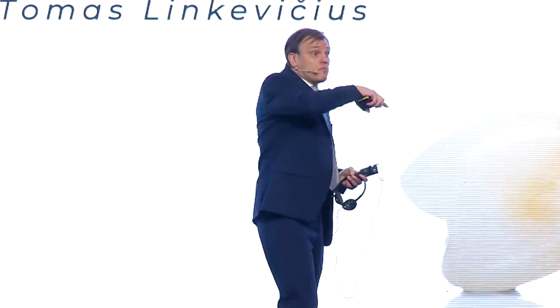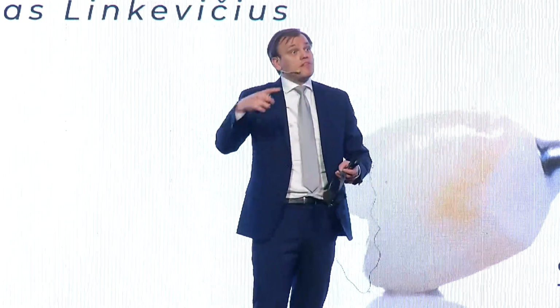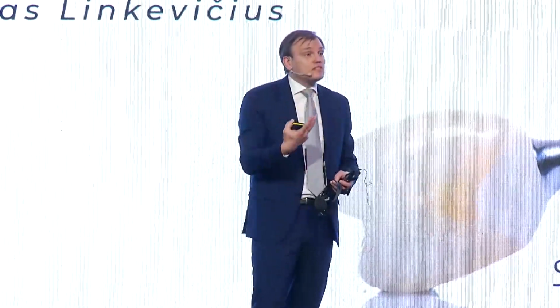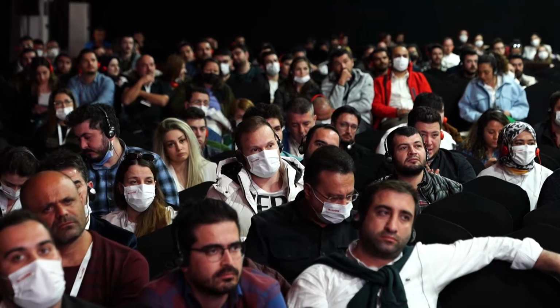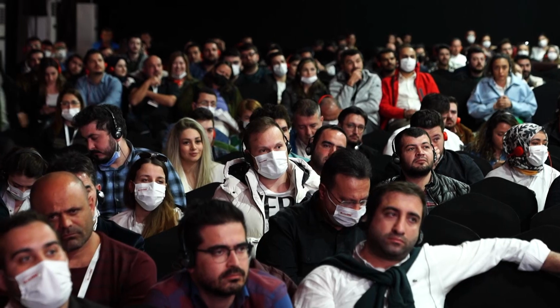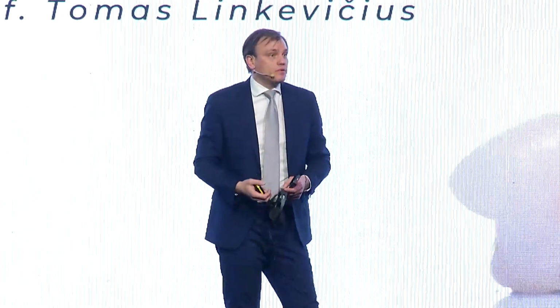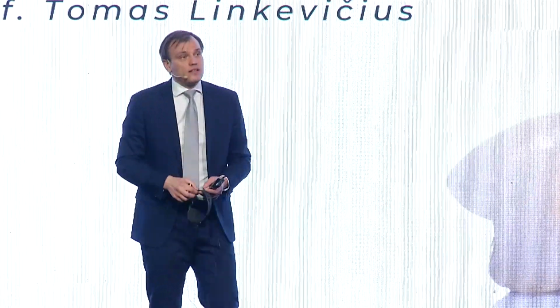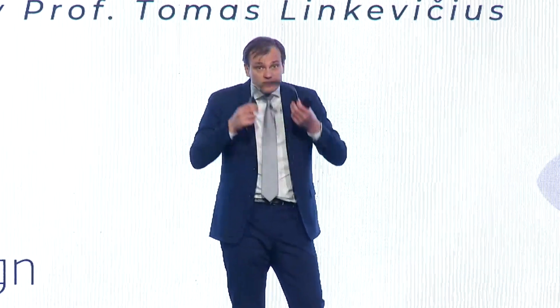Yeah, but then you can make this bar, right? But the bar of titanium doesn't go into the implant part. It goes only interproximally in the pontic. So it also depends on the lab. I also do zirconia like that on full arch cases as well.